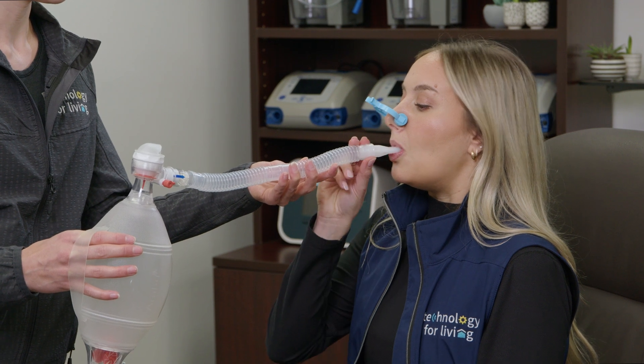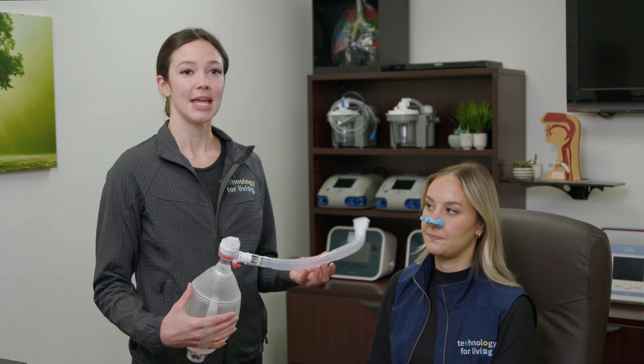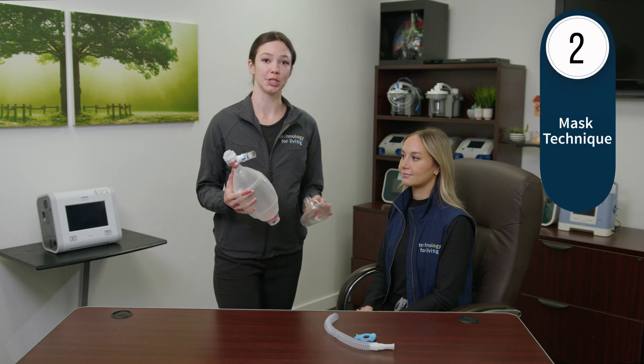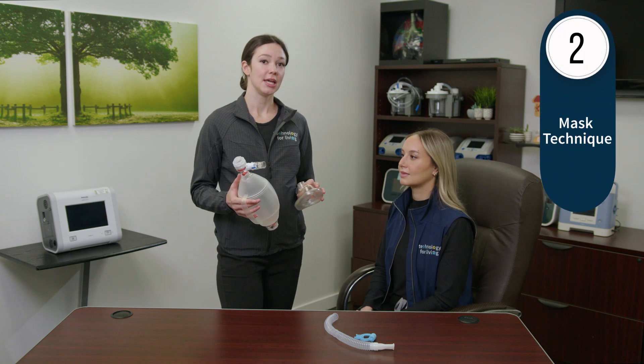It may be helpful to start with only one or two breaths and work your way up to a larger volume as you become comfortable and proficient with this technique. Remember, the goal is to deliver a larger volume than you can inhale on your own.